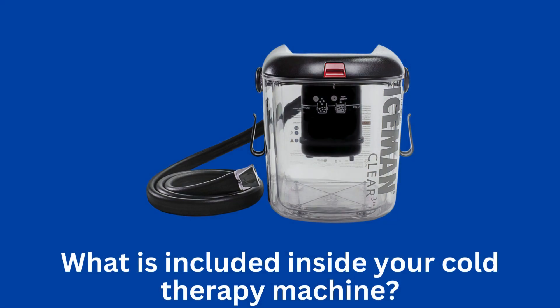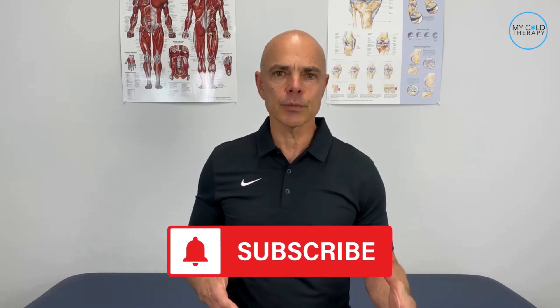If you want to know what comes with your cold therapy machine, you came to the right spot. We're going to show you what comes in the box when you get your cold therapy machine. Hi, it's Steve from MyColdTherapy, where we help people get back to living.